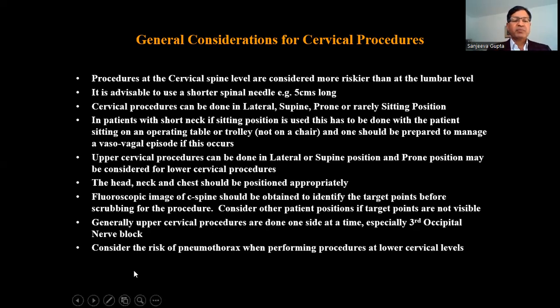Consider the possibility of pneumothorax when performing cervical or thoracic procedures, especially the lower cervical levels. When I perform lower cervical procedures, especially C6 or C7 levels, I warn the patients about pneumothorax and I advise them not to fly in an aeroplane for around 7 days or so.